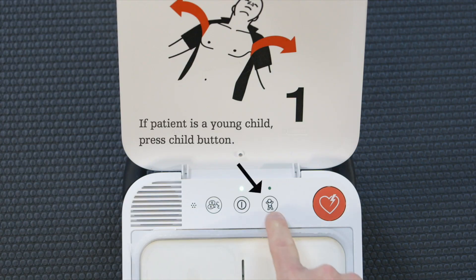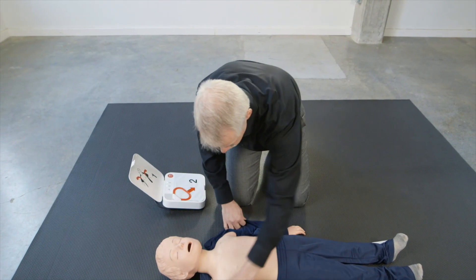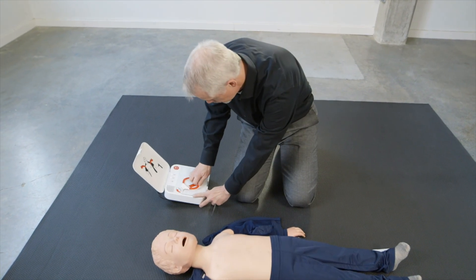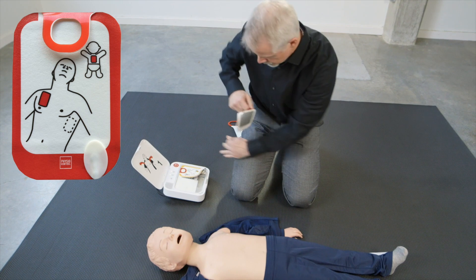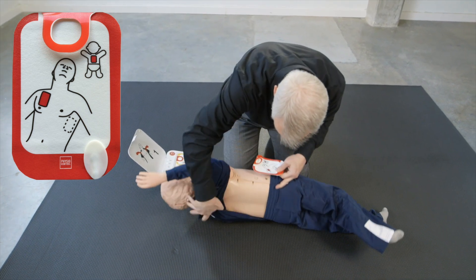Remove all clothing. Child mode. Remove all clothing from patient's chest. Pull red handle to reveal pads. Look at pictures on pads. Apply pads to bare skin exactly as shown in the pictures. Press pads firmly.